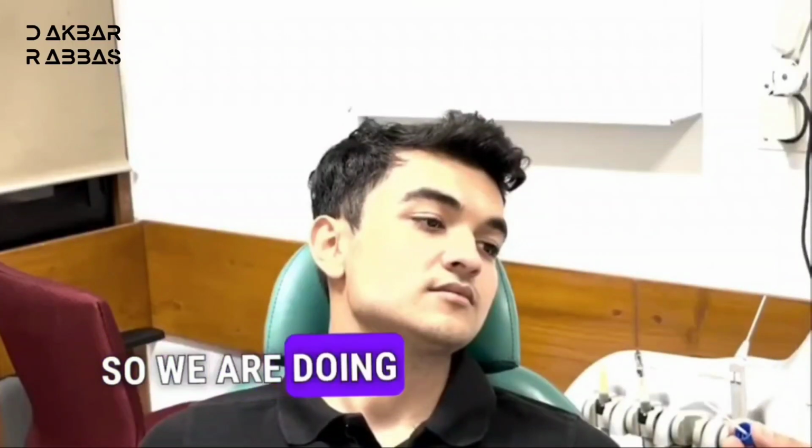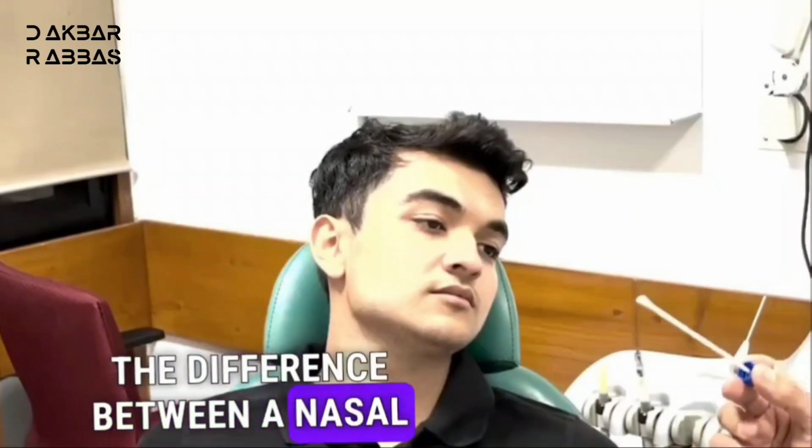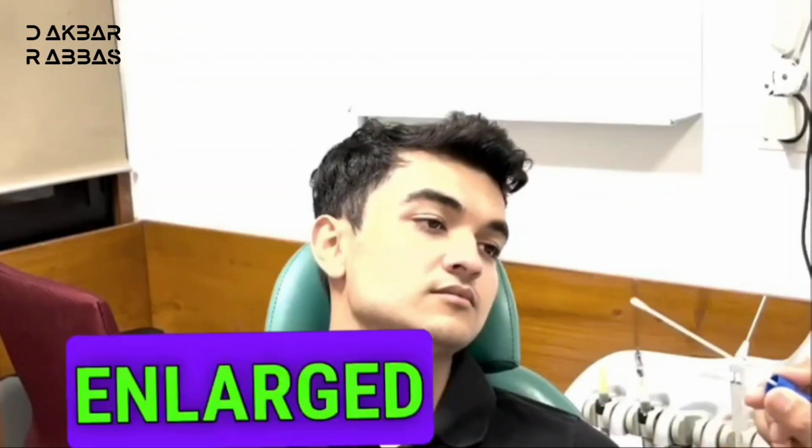So we are doing a nasal probe test. This test will determine the difference between a nasal polyp and a turbinate. If the probe can go all around the swelling, it is likely to be a nasal growth or a nasal polyp. But if it cannot go all around, it is likely to be an inferior turbinate or a large middle turbinate.